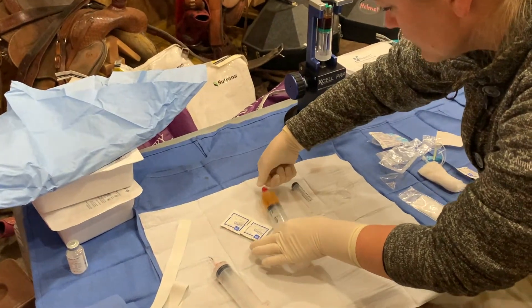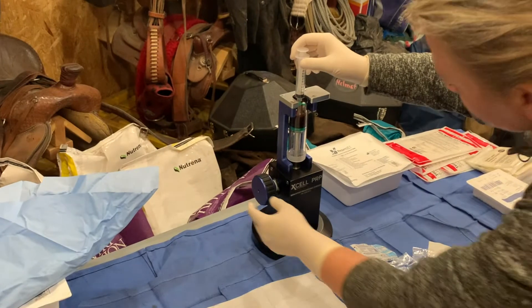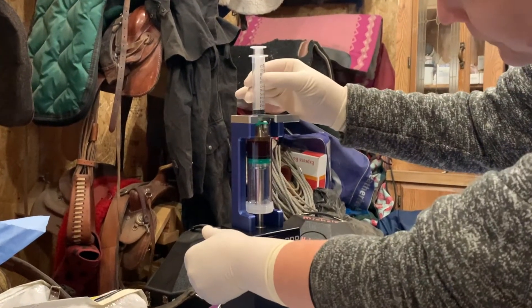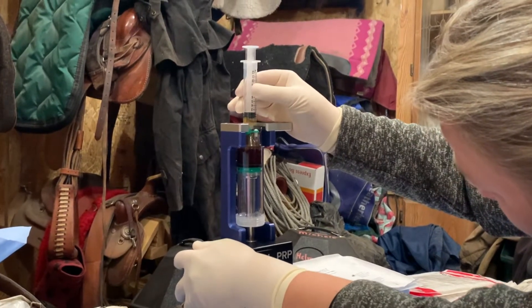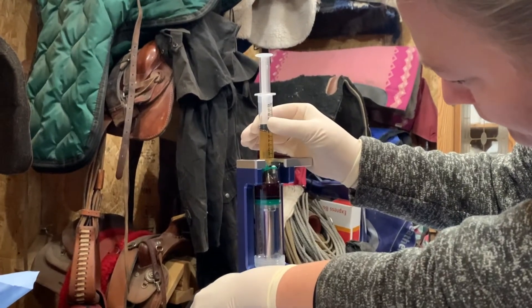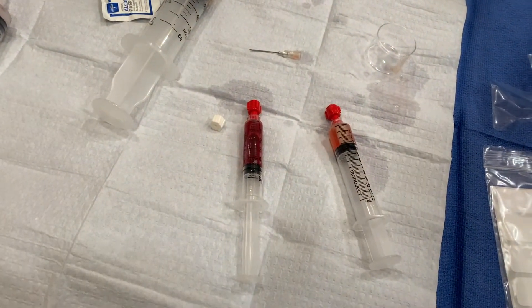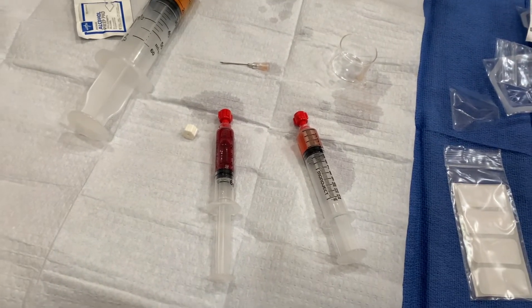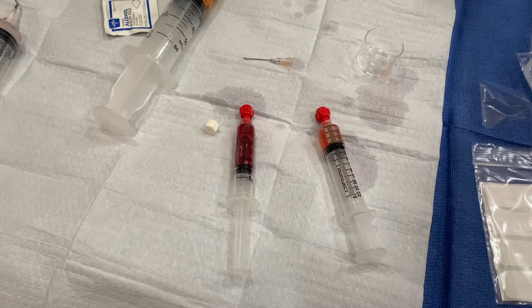You can either dispose of that or, if you were doing protein concentrate, you would filter that platelet-poor plasma down. Now we'll take the 12 ml syringe and do the same thing — push that on top. Since this is going into a joint, let's go up until the buffy coat gets right in there. As the buffy coat gets to the top, there's going to be a little poof of red, then stop. We actually pulled two different injection mixtures: the lighter one is for the joint, and the more red one is leftover PRP put into a second syringe for soft tissue. The lighter one goes into the stifle.